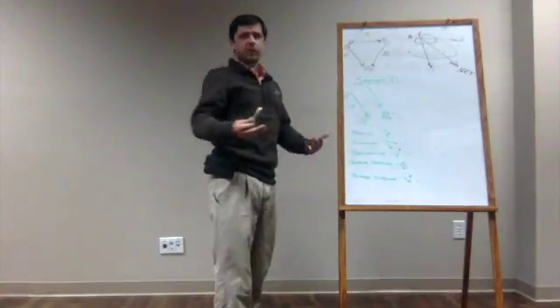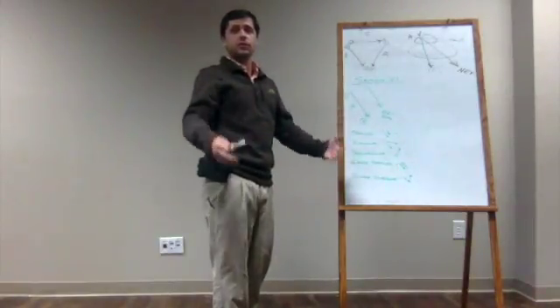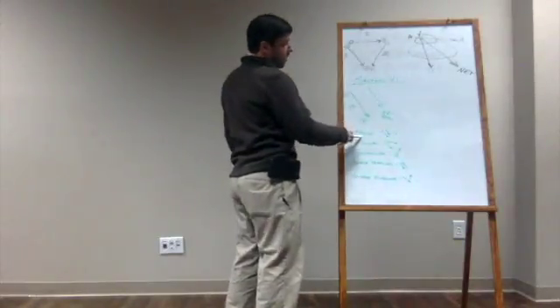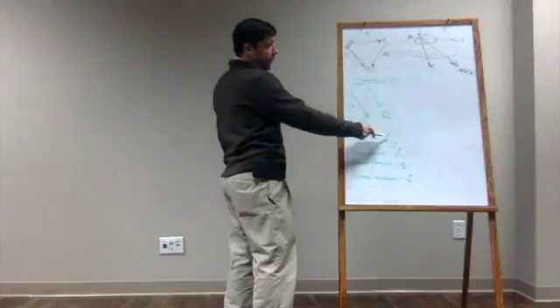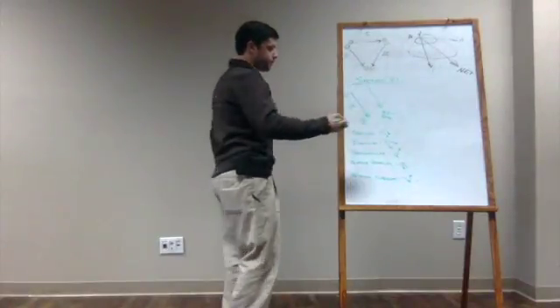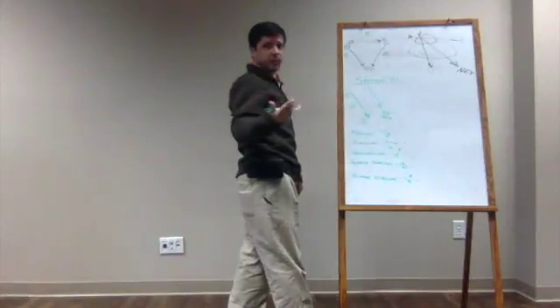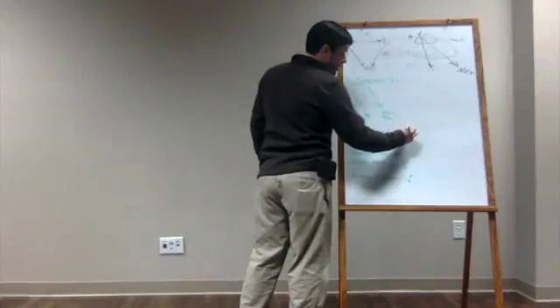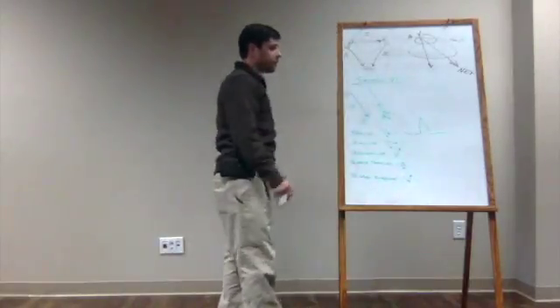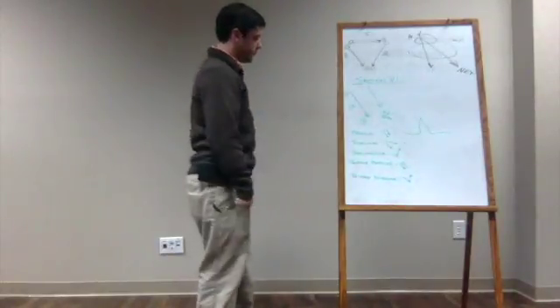This is also the reason lead 2 is the preferred lead when viewing cardiac conduction in an EKG, whether 4 lead, 3 lead. So when you have a parallel conduction pathway, this will actually yield the largest possible positive deflection on an EKG, which our net depolarization with lead 2 will yield. Because depolarization being positive leads like positive activity, we'll give it a big thumbs up when it's parallel.